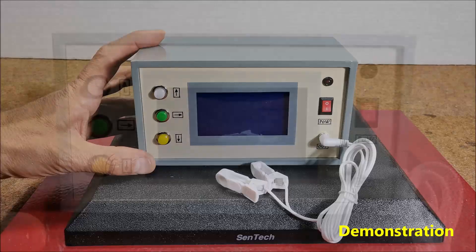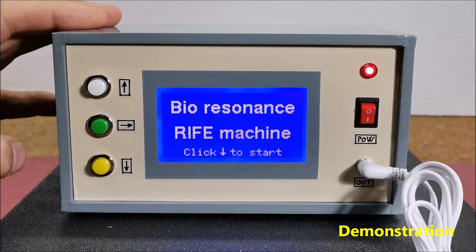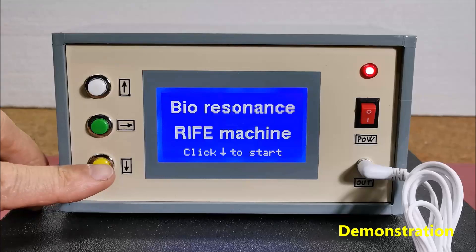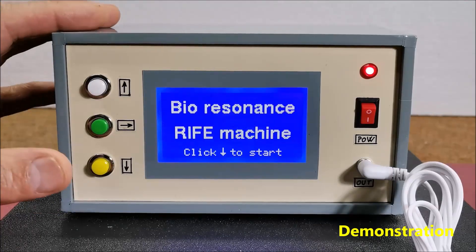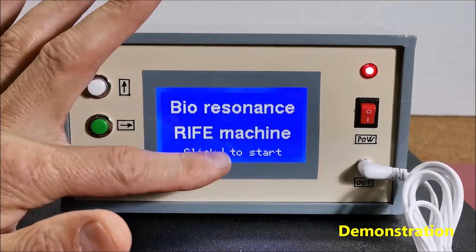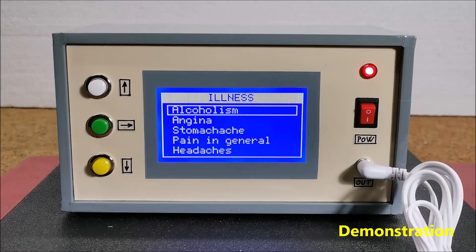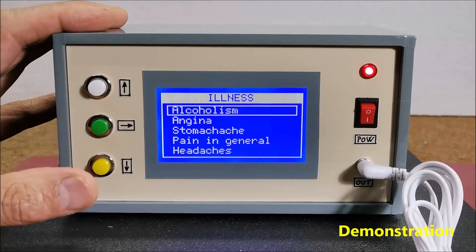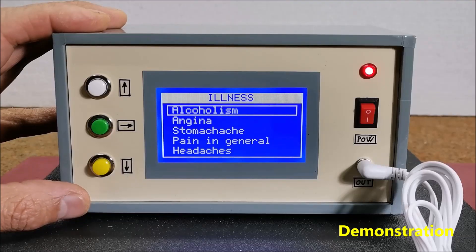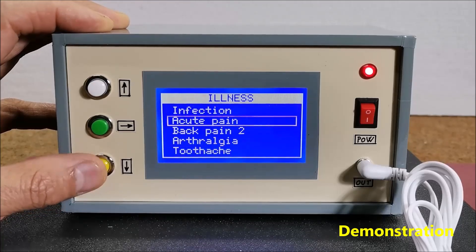And now let's see how the device works in reality. The start menu appears when turned on. By pressing the down button, we enter the submenu in which we select the disease for which we want to apply the therapy. The code includes frequencies for therapies for 31 diseases, but given that Arduino works with about 10% of its resources, we can very easily enter frequencies for many other diseases.